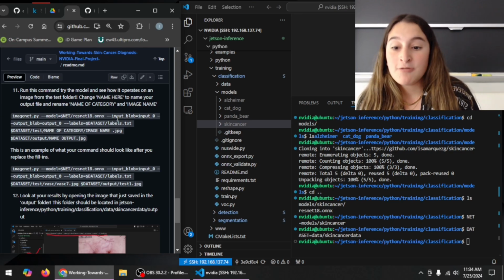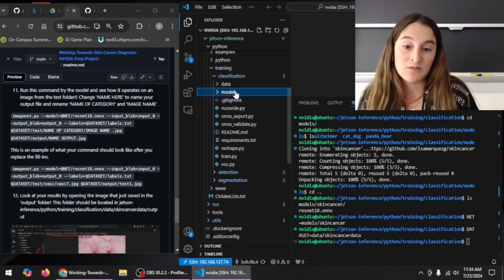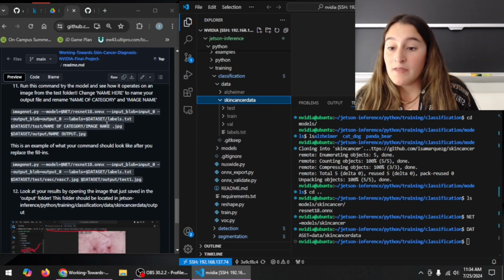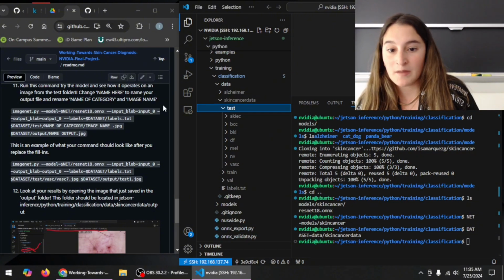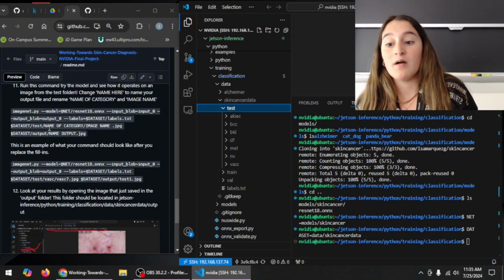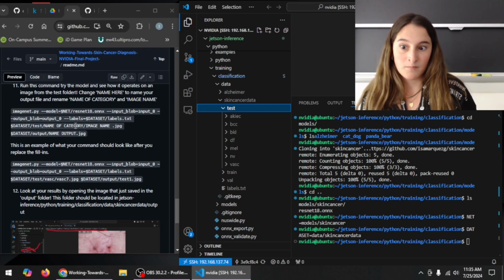And then as an input, we are setting them over here. Well, labels, we're also setting them as labels text, since those were saved with our data as well. Right here, labels text. And then as for our inputs, we are doing our test folder. It's just already defined that we wanted to come here to skin cancer data, and then test, and then I just left this blank so that you could test it with whatever you want.